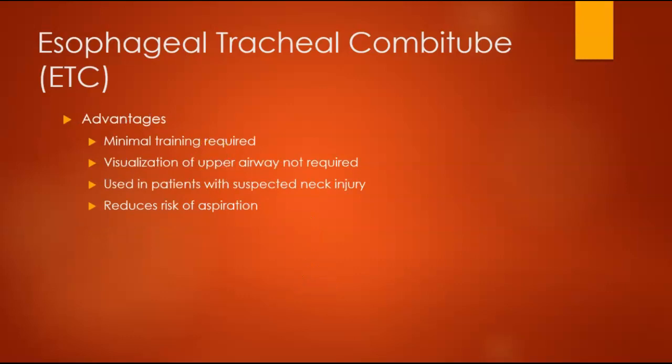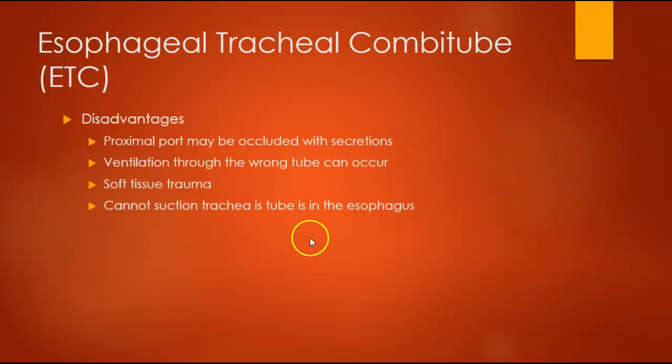Okay, so advantages again, it doesn't require a lot of training. You don't have to visualize anything because you're just inserting it down the airway. We use these in patients with suspected neck injuries because I don't have to tilt the head back or anything. And because I'm sealing off the esophagus, I'm reducing my risk for aspiration.